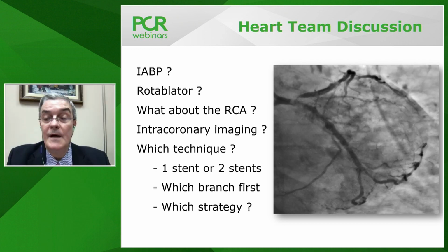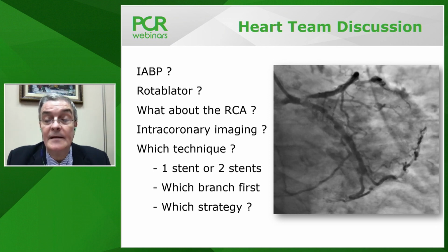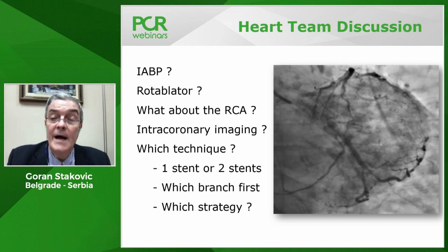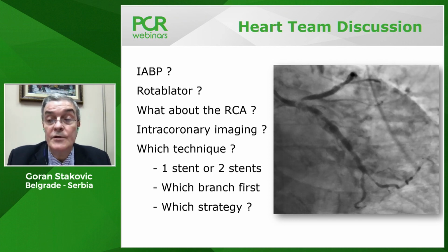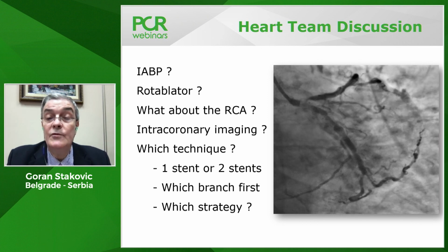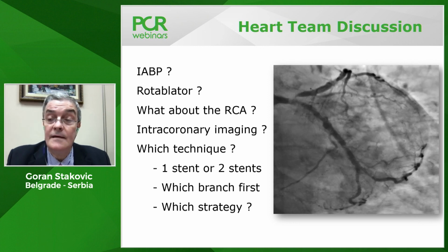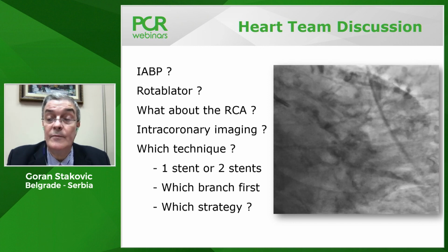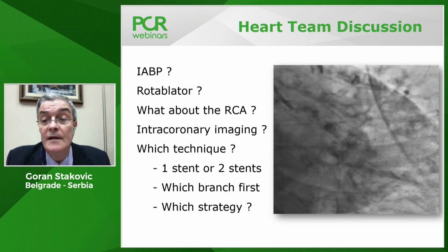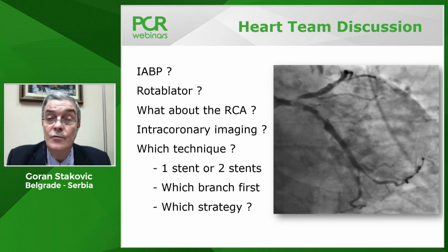Yeah, thank you very much. I agree with you that a 2-stent strategy is something that everybody is expecting in this kind of complex anatomy in both vessels. My personal approach, based on the experience I have with culotte, will probably be to use culotte. So whether it's inverted culotte or a straight provisional culotte starting from left main towards the LAD, as Thierry nicely pointed out, which was not clear to me in the beginning, is the complexity of access to the LAD.